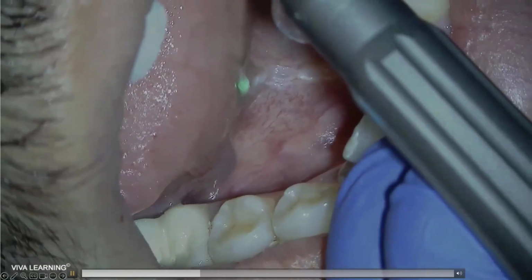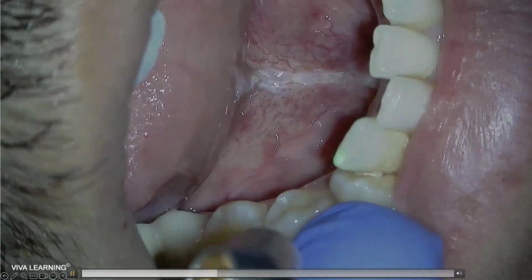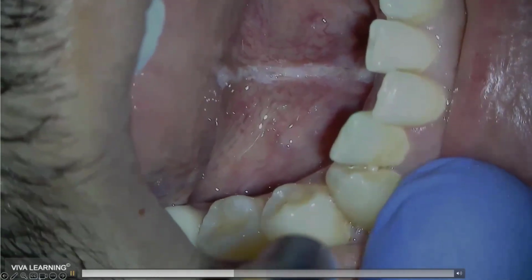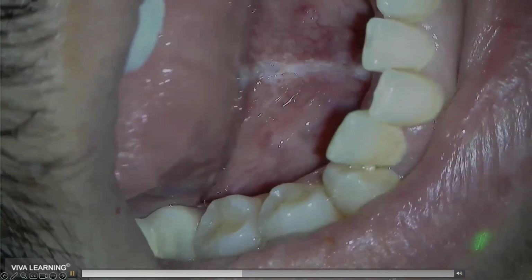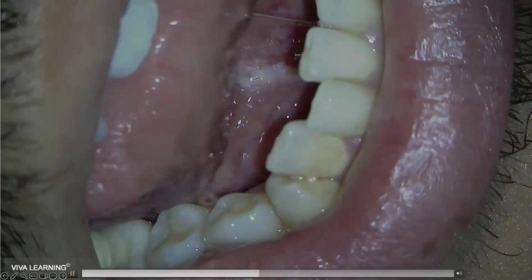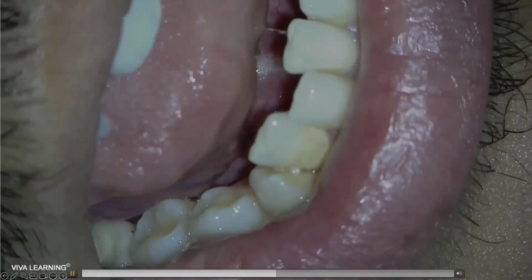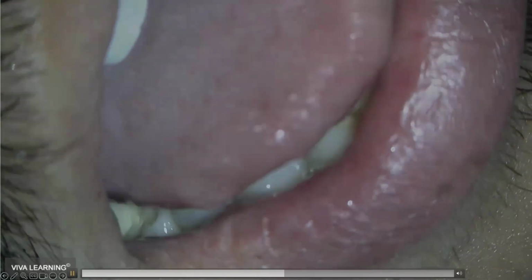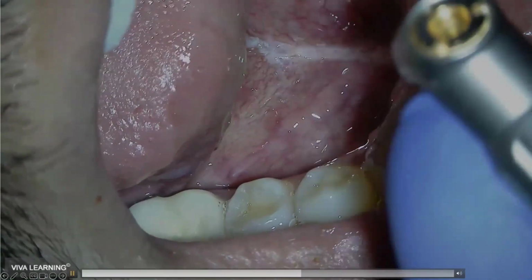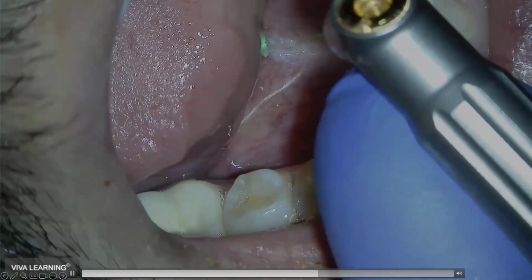And this is where questions come up, like, what's the technique here? How hard is this? Gosh, I haven't done surgery since dental school. Basically, it's a matter of you point it at it, it's going to cut it. And you can see in the video, I'm starting to have them do some exercises to stretch out to determine how much more I need to laser. But you basically stay in the middle for safety. Don't go to either side of the tongue where the lingual nerve or lingual artery is. Just stay in the middle.